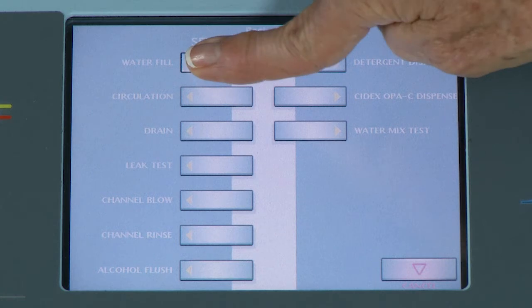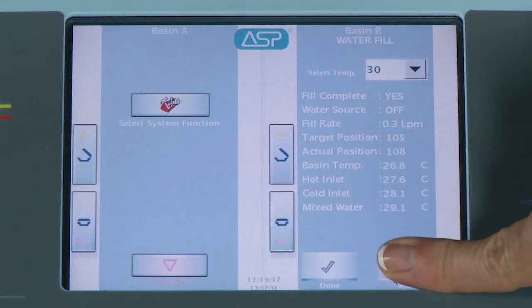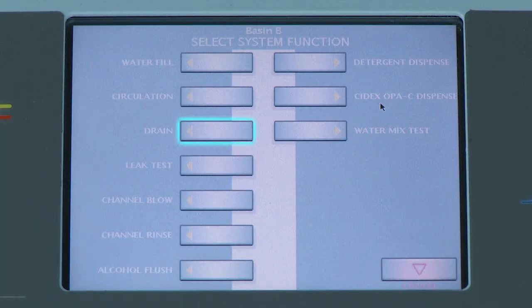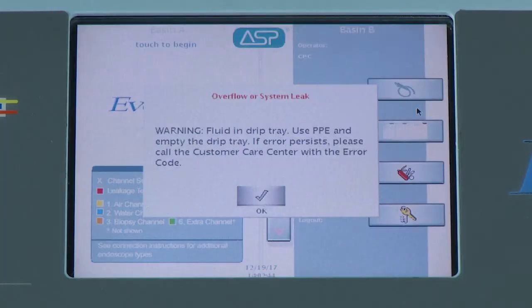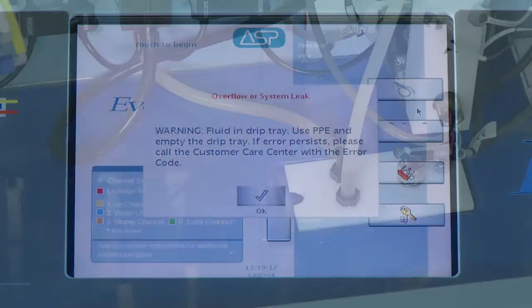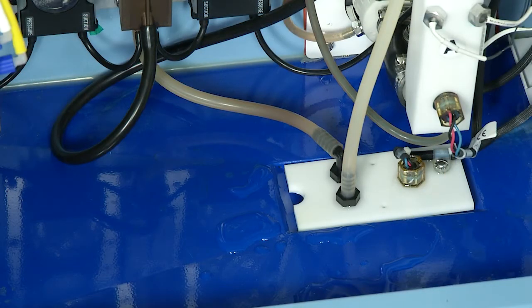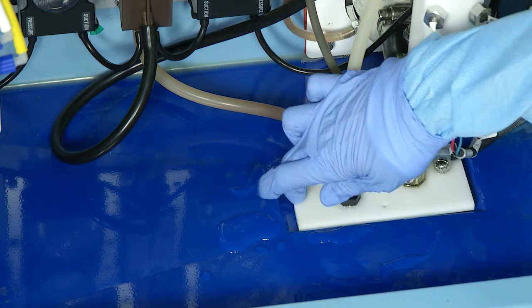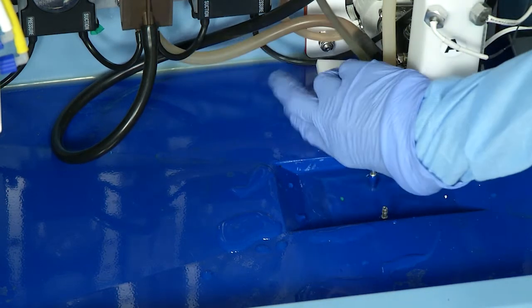Then perform a water fill while watching for any leaks. Finally, drain. If a message is displayed indicating that there is a system overflow, the drip tray needs to be cleaned. The drip tray is located under the white plate in the middle of the unit. To clean, place your finger in the indentation on the left and lift up the plate.